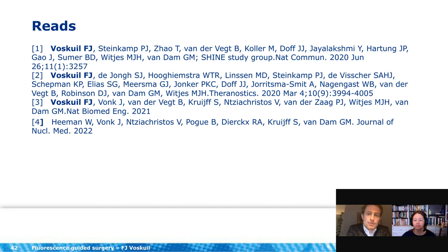Yeah, that's a great question, and I think one of the most important topics, especially when you're analyzing a compound for the first time. So we did backwards planning, so to say. First we asked the pathologist to delineate the tumors on the H&E section without knowing any fluorescent results. Then we overlaid those H&E sections on the tissue slices of which we collected fluorescent imaging images.